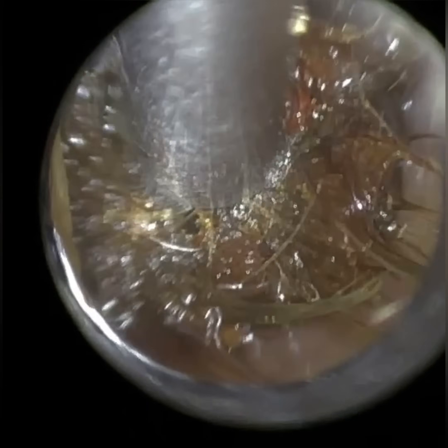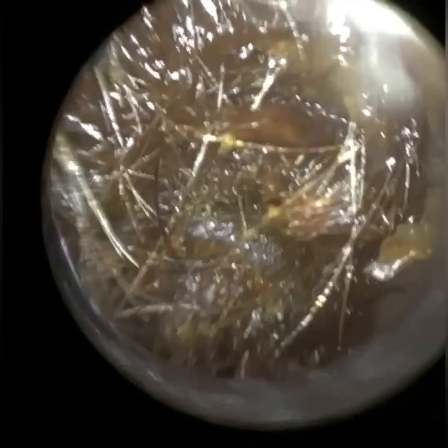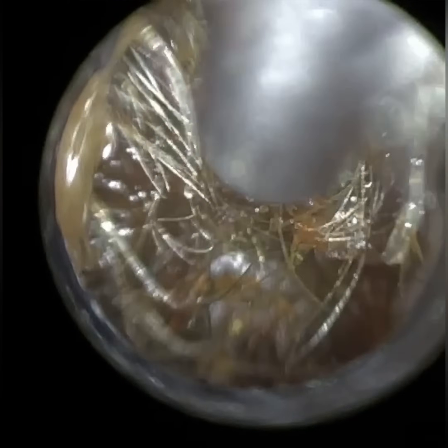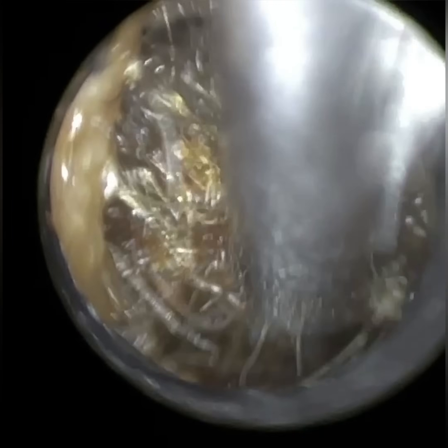This is the more medial wax — the bit that's really impacted against the patient's eardrum. It's lodged beyond the isthmus, which is a narrowing. There are actually two isthmuses within the ear: one between the first and second bend of the ear canal, which is the narrowest portion on the outer lateral third; and another about half a centimetre away from the eardrum, where the canal narrows and widens. This wax has been pushed beyond that narrowing and lodged in the wider section, so we have to retrieve and pull it through.